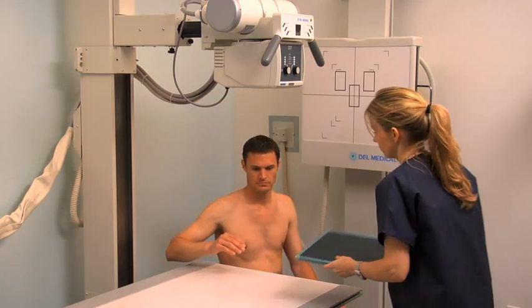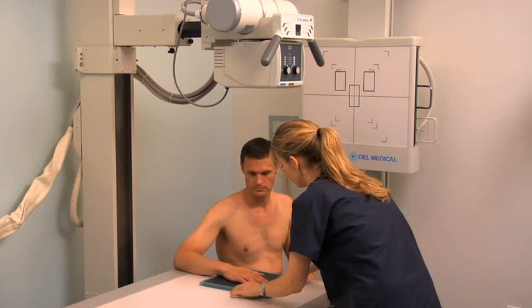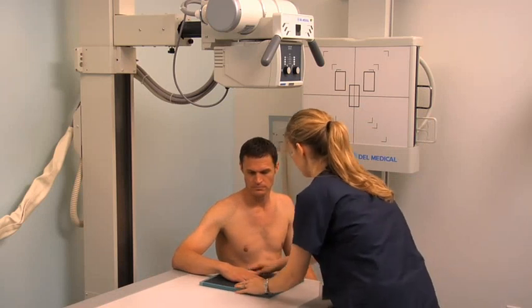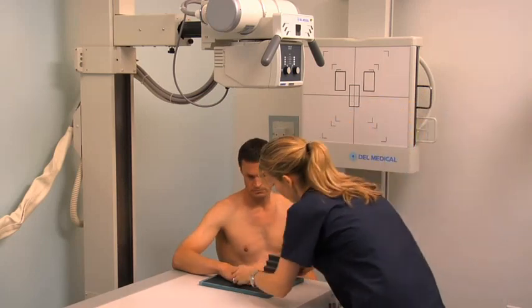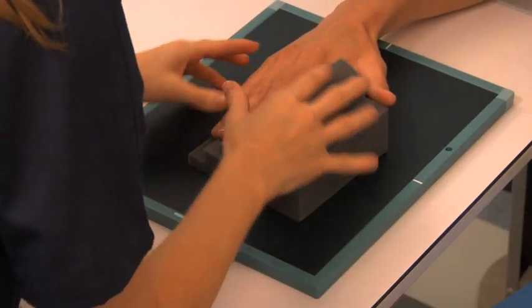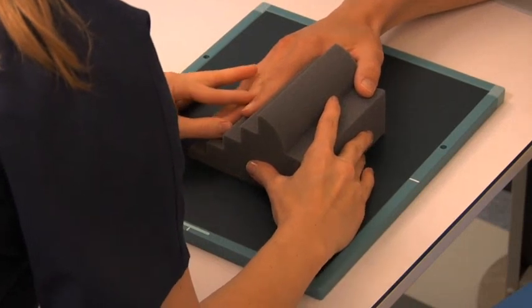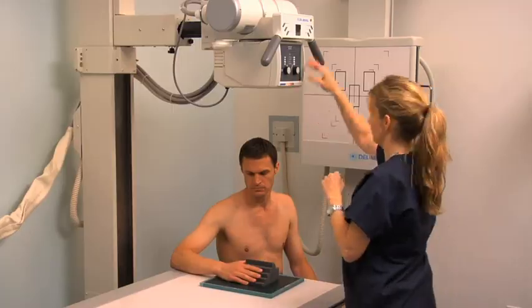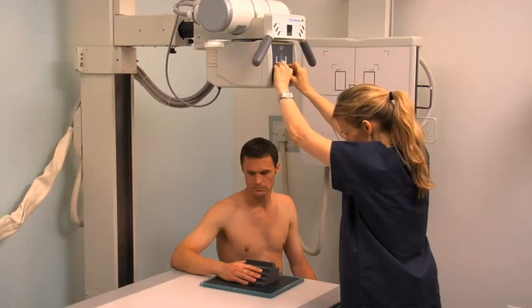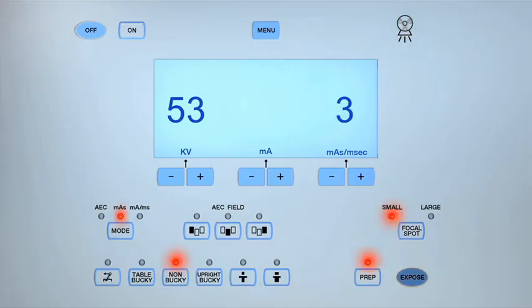For an oblique projection, place a second 8-by-10-inch cassette on the tabletop. Reposition the patient's arm and rotate their hand and forearm 45 degrees laterally. Separate their fingers and support them on a stepped 45-degree angle radiolucent sponge. Align the finger with the center of the cassette and position the central ray over the proximal interphalangeal joint. Collimate to include the same structures as for the PA projection and expose the cassette.